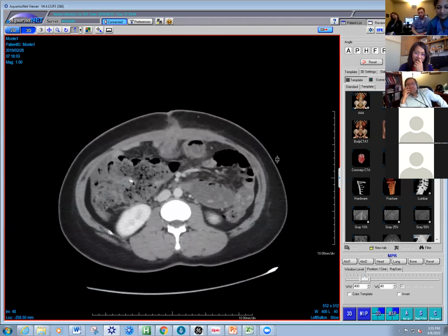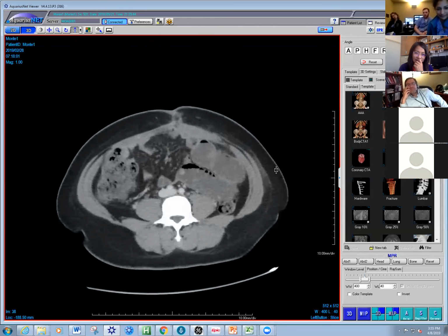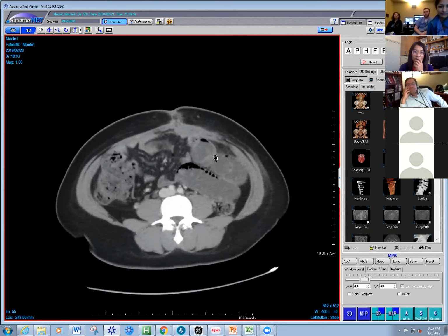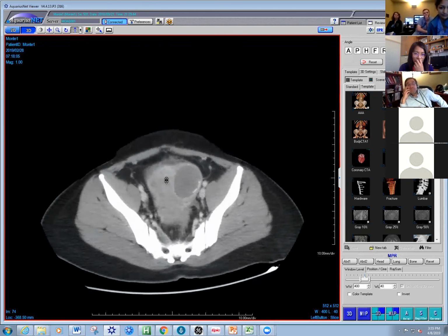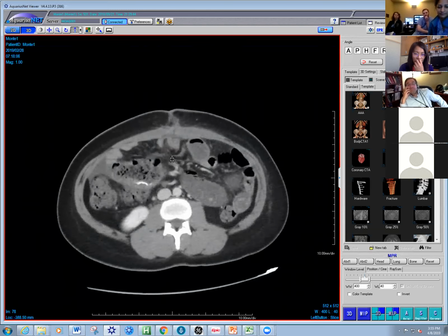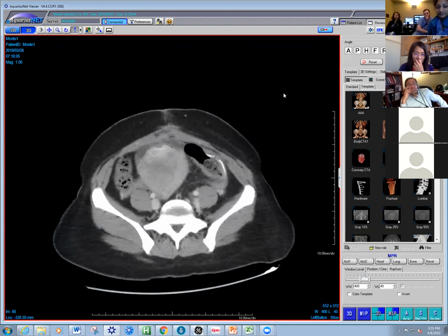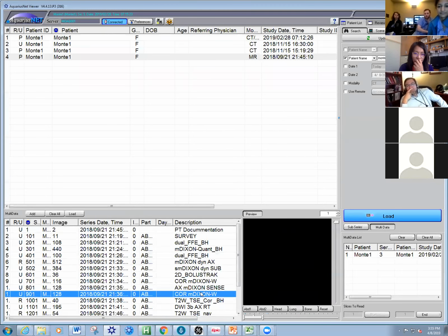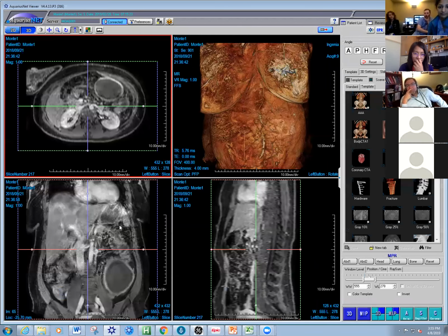Okay, so this is the QA part of the story. Because they thought this was an actual mass, they resected part of the colon and part of the small bowel, which was unnecessary. The patient later came in with small bowel obstruction, and it's a big QA issue now. Although radiology is not the one who left the towel in, the point here is first to take a look at what Gossypiboma looks like on MRI, because I think this is the first time I've seen it on MRI.